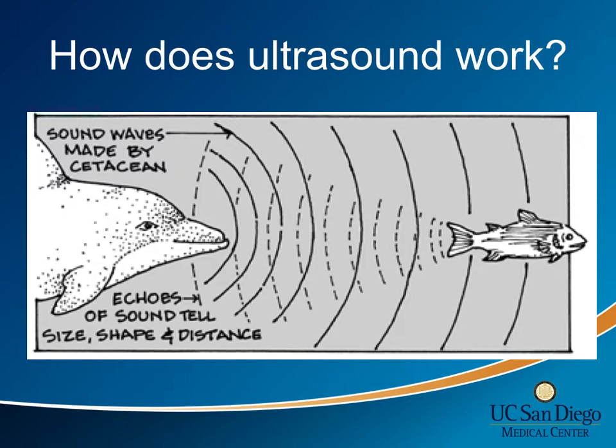So how does ultrasound work? At the most basic level, ultrasound is the propagation of a series of sound waves through a medium. Any echoed signal that bounces back to the source of those sound waves is used to create an interpretation of its surroundings.